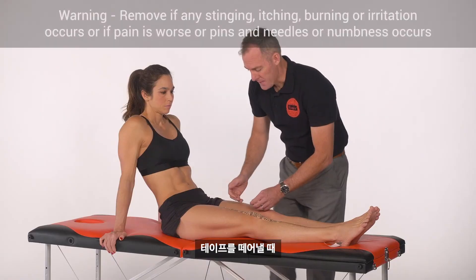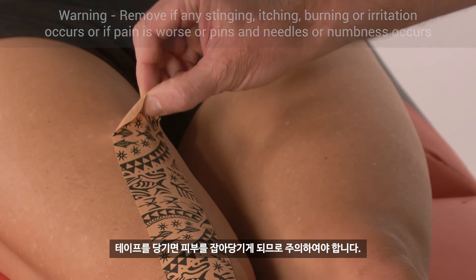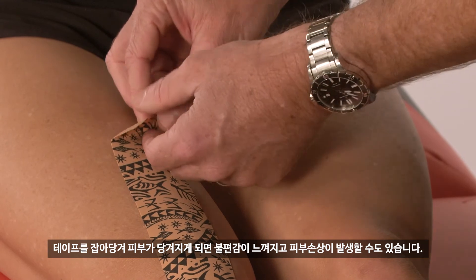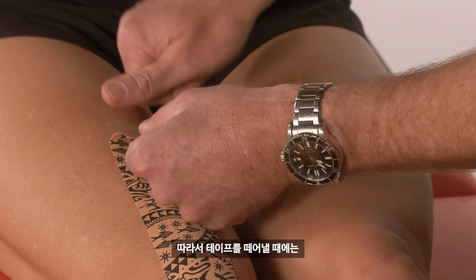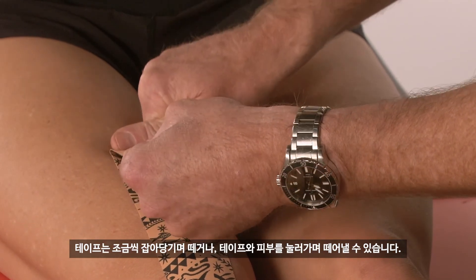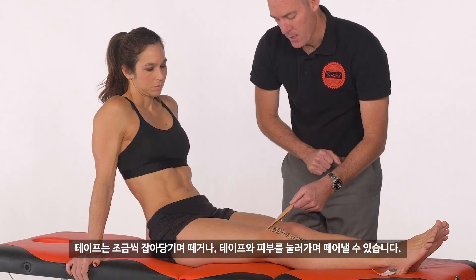When we remove the tape, it's important not to pull up on it. As you can see, that traction is on the skin — it's far more uncomfortable and more likely to cause trauma to the skin. So we need to pull the tape back along itself and hold the skin down at the same time. If anything, we sort of pull the skin away from the tape in short, sharp increments.